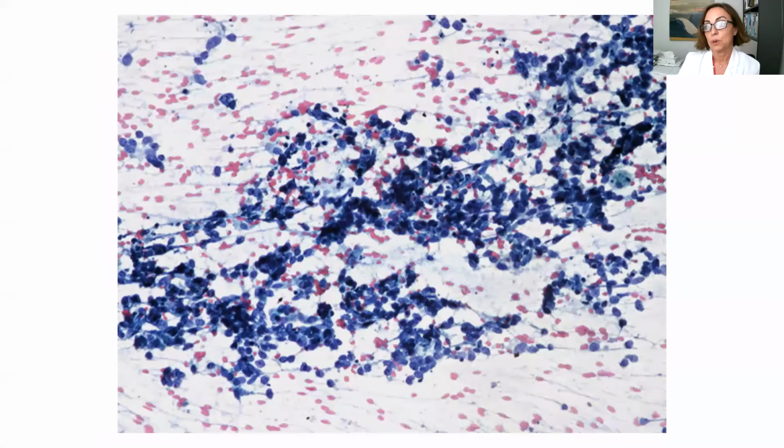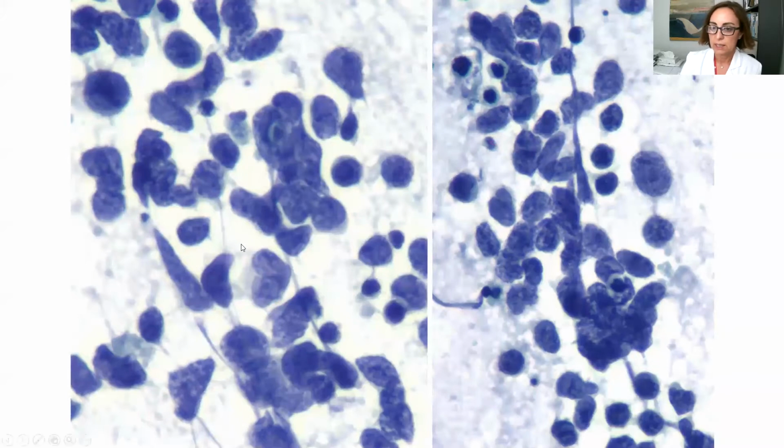And here there is no problem for any of us to diagnose a small cell carcinoma. If you see this case at a higher power, you see the crush artifact of the chromatin and the nuclei hyperchromatic without nucleoli, and with this, more than not, so small cells.